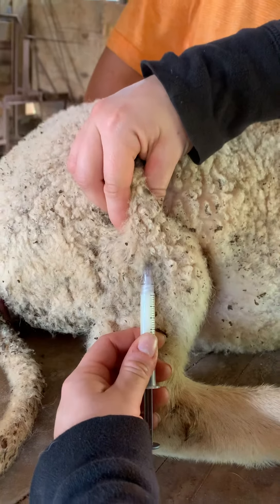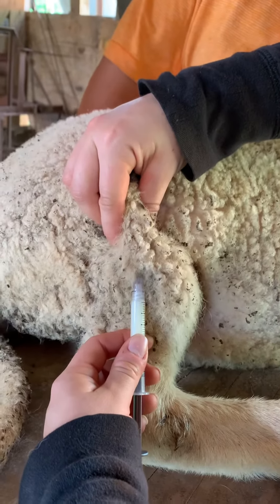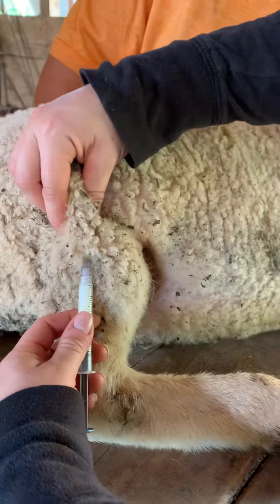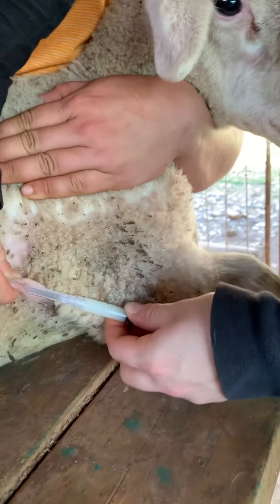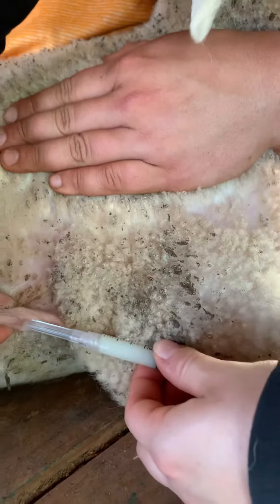If their leg is tight or stretched out or they're standing up, you might have less loose skin to go under. Another area that's pretty common — it's a little harder to see what you're doing, but there's not so much wool — is their armpit. There's no wool there. You can pull that up and you can go in. There's less area to go in, but it still works good.